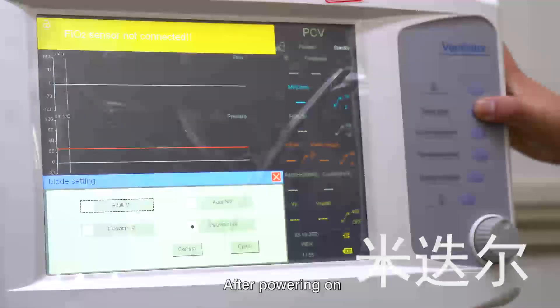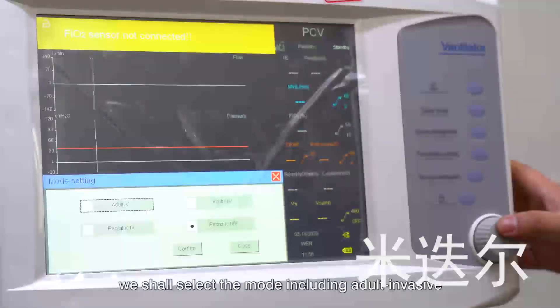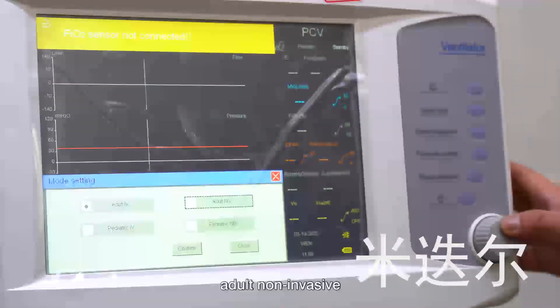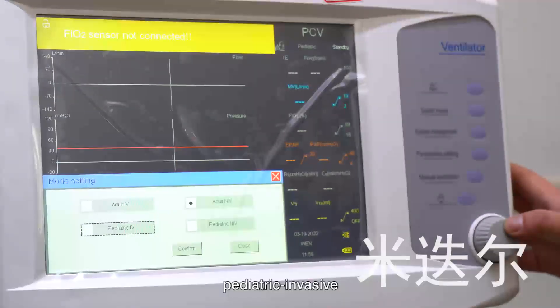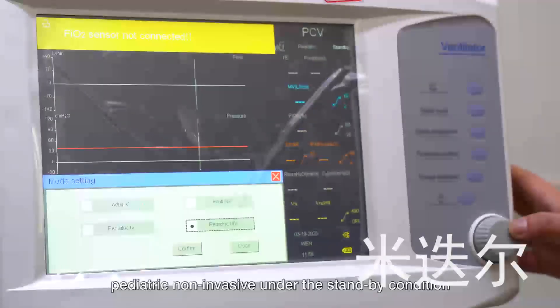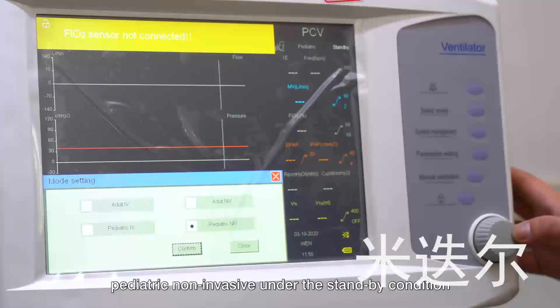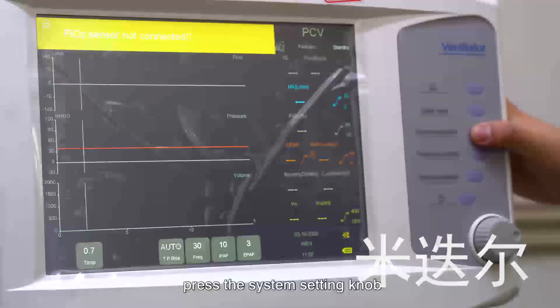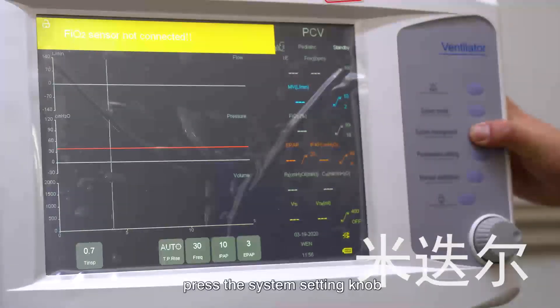After powering on, we shall select the mode including adult invasive, adult non-invasive, pediatric invasive, pediatric non-invasive under the standby condition. In order to enter the standby mode, press the system's setting knob.